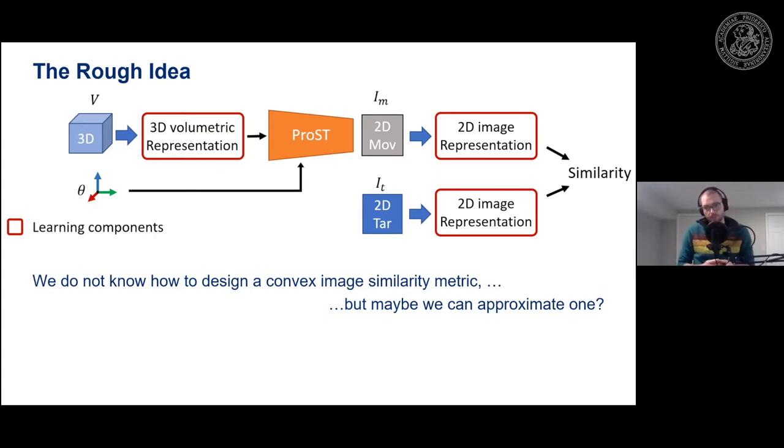The problem with this, however, is that you can see already that in this specific problem set that we're describing, we have a three-dimensional representation that is then mapped onto a two-dimensional X-ray image. And this is then compared to the actually acquired two-dimensional X-ray image.